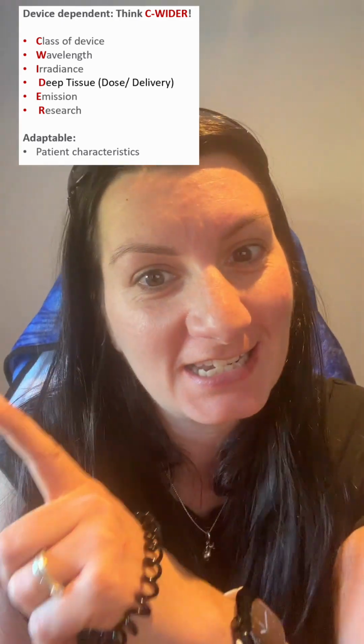We're now on D, and D covers two main areas, both dose and delivery. And these two are really, really important parts. I always say, would you only take half a paracetamol if you had a broken arm? No, of course you wouldn't. You would take the full dose. This is something I see time and time again when it comes to laser: how often we are underdosing our patients. And that's when the outcomes become a little bit more difficult, shall we say.